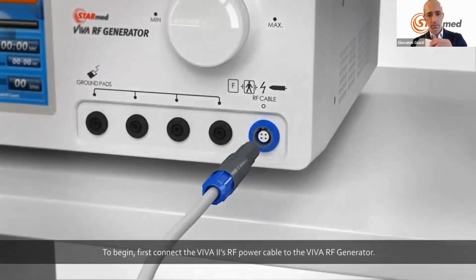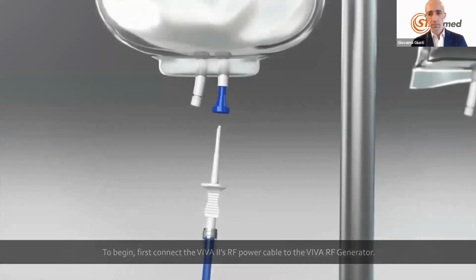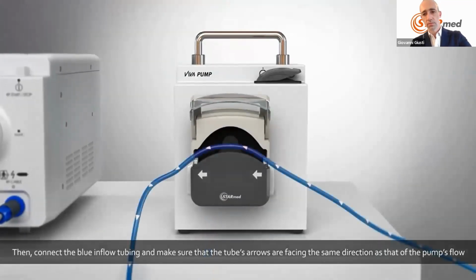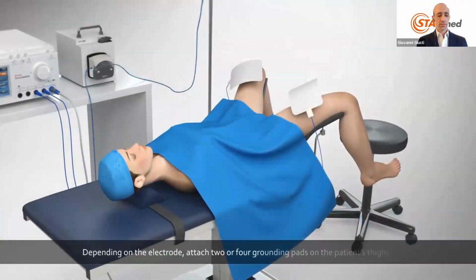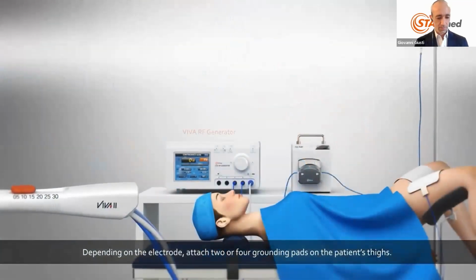To begin, first connect the Viva 2's RF power cable to the Viva RF generator. Then, connect the blue inflow tubing and make sure that the tube's arrows are facing the same direction as that of the pump's flow. Depending on the electrode, attach 2 or 4 grounding pads on the patient's thighs.